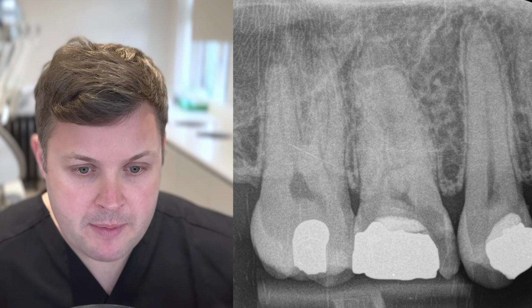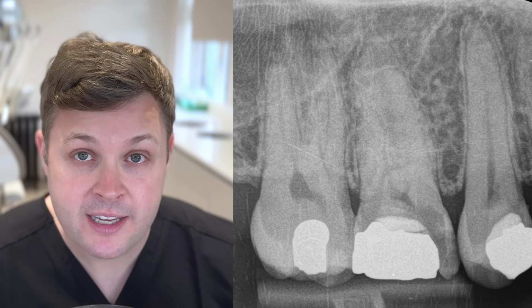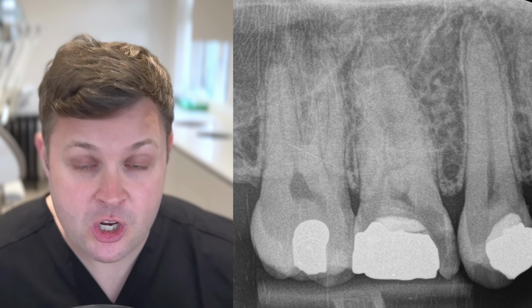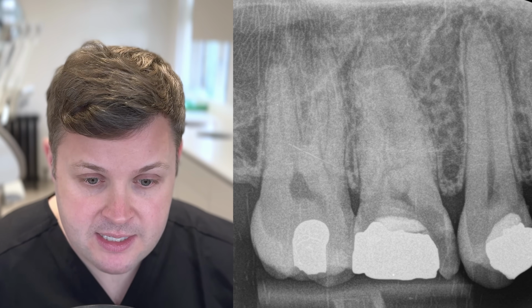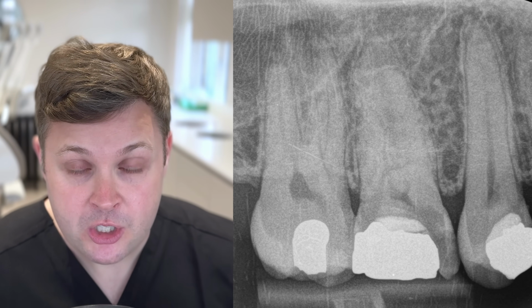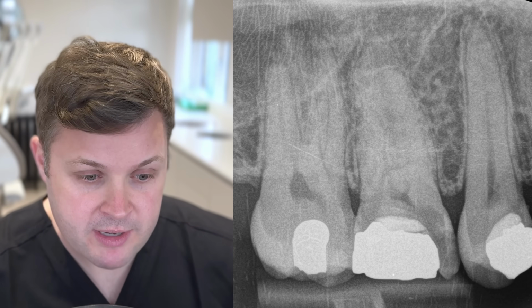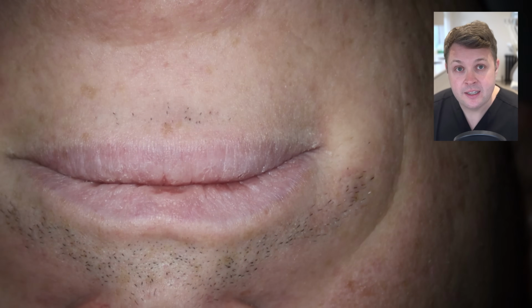And straight away in my mind, what I'm thinking is: is this tooth supercalcified, or has it got an unusual root form? So it's something you just got to keep your eye on when you're accessing these teeth. It's also got decay in the tooth, and it's got a failing restoration. So in the very first instance, what we need to do is remove this restoration and check its restorability. And we move over to the video here.